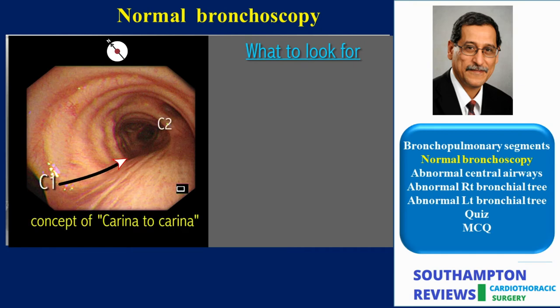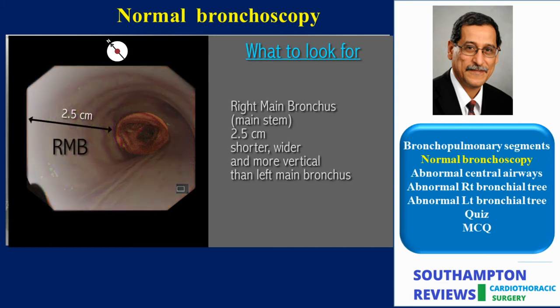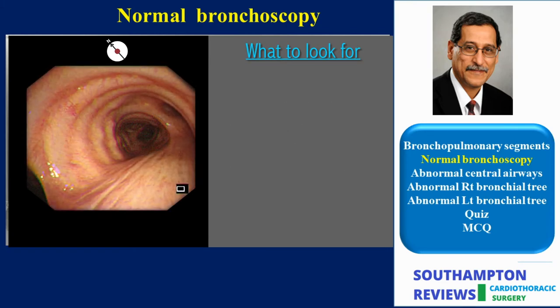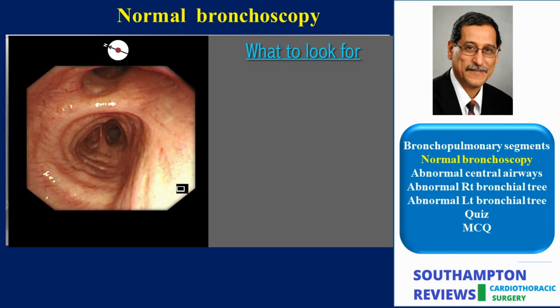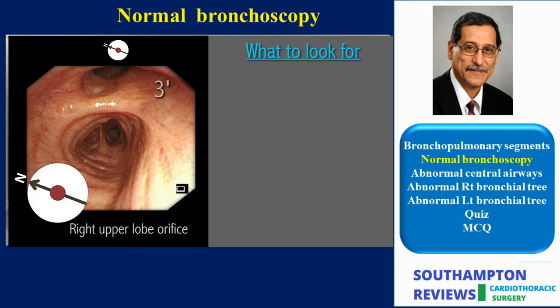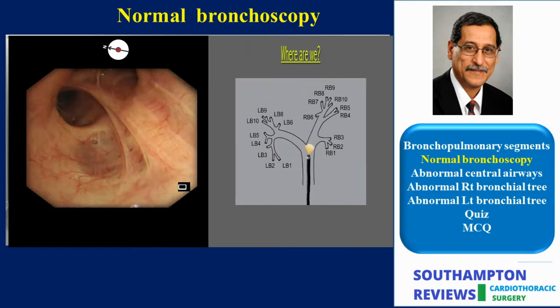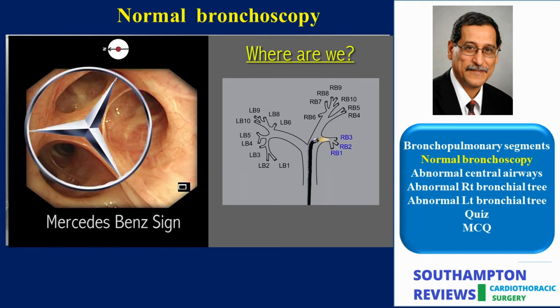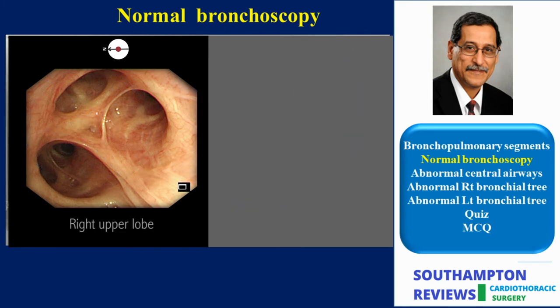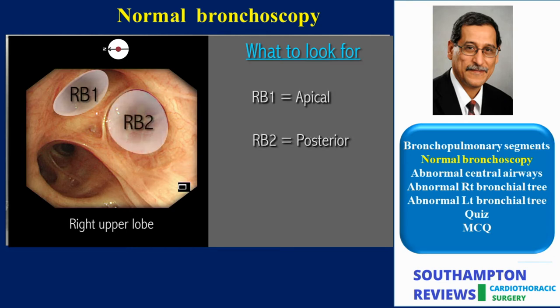The concept of carinae-to-carinae will repeat itself in this video several times. As the scope turns to negotiate the segmental orifices, the scope is turned 90 degrees to the right and the takeoff of the right upper lobe can be seen at 3 o'clock. On advancing the scope further down the right main bronchus, one is greeted by the Mercedes-Benz sign, which helps identification of the right upper lobe bronchus. The latter divides into three segmental bronchi: apical or RB1, posterior or RB2, and anterior or RB3. R stands for right and B stands for bronchus.